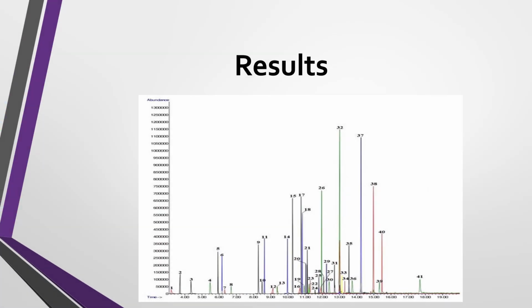Here's what the results look like for 41 drugs. Of course, it would be highly unlikely that any one person would have all 41, so your actual results would not be as cluttered as this. But you can tell that if you expand your graph and magnify it, you can see each of the 41 peaks, each a different drug.